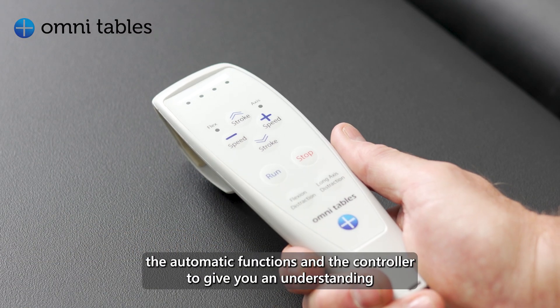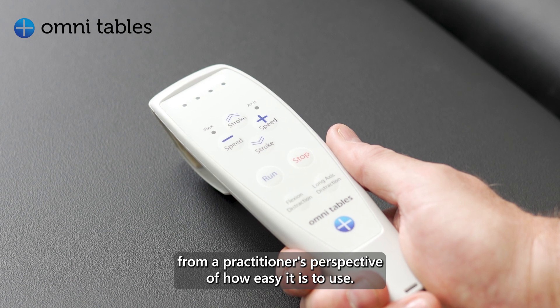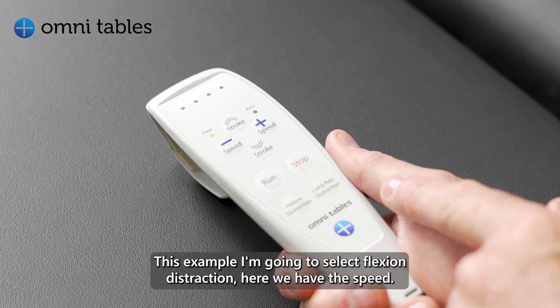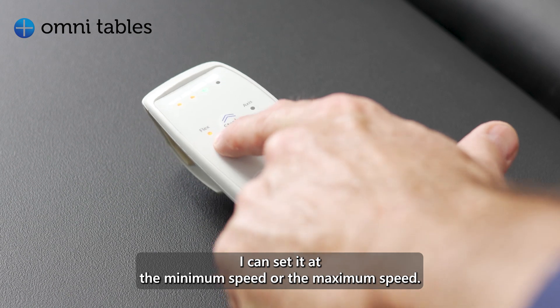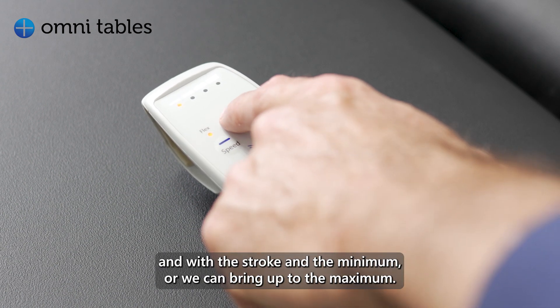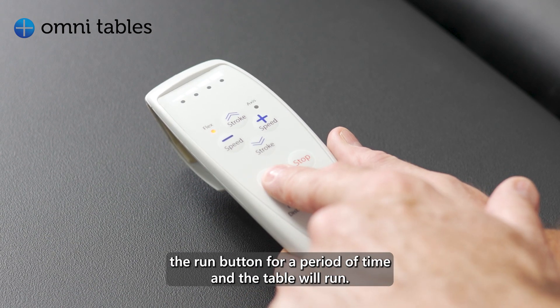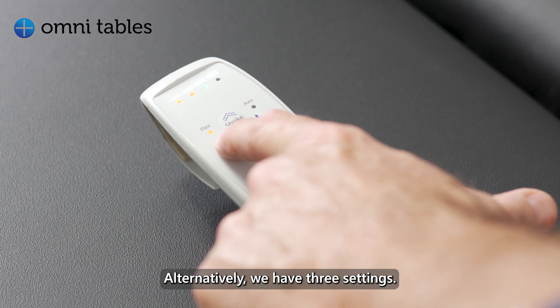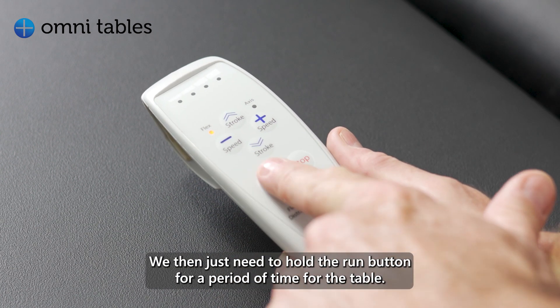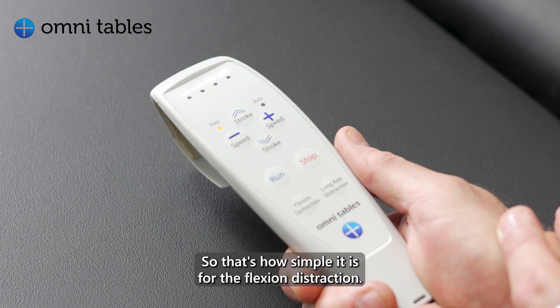I just want to go through the automatic functions and the controller to give you an understanding from a practitioner's perspective of how easy it is to use. We have two options: flexion distraction and long axis distraction. Selecting flexion distraction, we have the speed which I can set at minimum or maximum, then we look at the stroke — minimum or up to maximum — and once we agree, we push and hold the run button and the table will run.